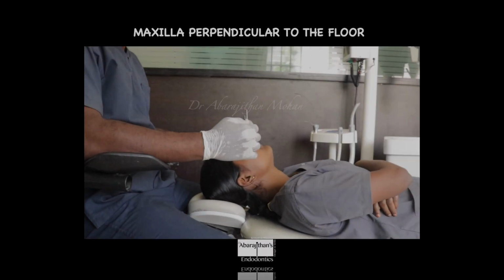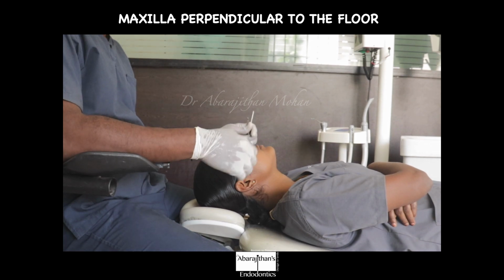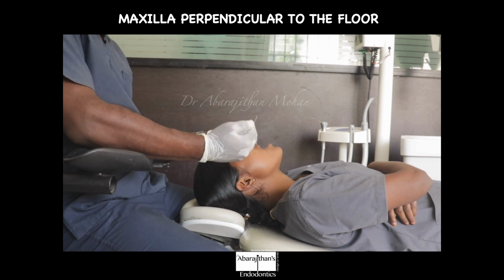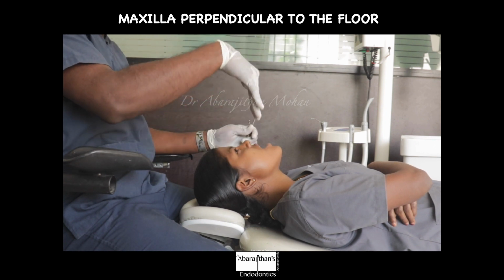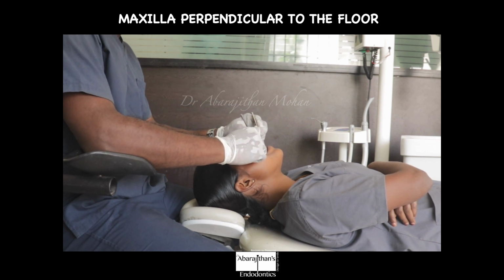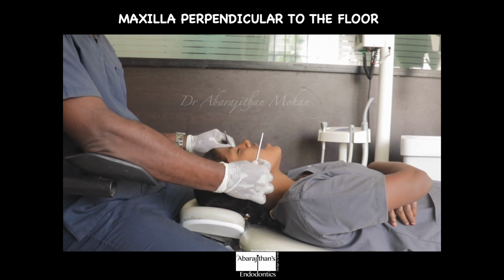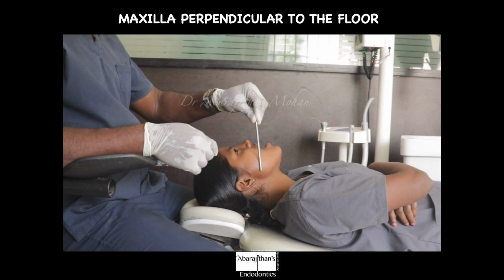There is a subtle difference to the maxillary teeth. When it comes to maxillary teeth, the patient needs to be in an even more supine position, and the maxilla needs to be completely perpendicular to the floor. That's the only difference. The mandible needs to be parallel to the floor when the patient keeps her mouth open for mandibular teeth, whereas the maxilla needs to be perpendicular to the floor. So this means the patient has to be kept a little more supine, the chair has to be adjusted further. This is the basic guideline, but otherwise the tooth still has to be at the level of the elbow.